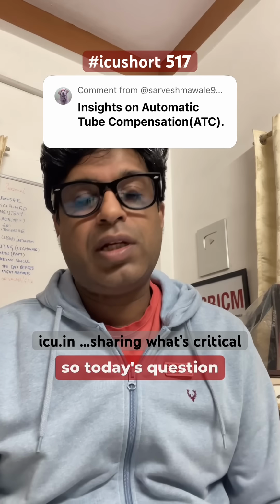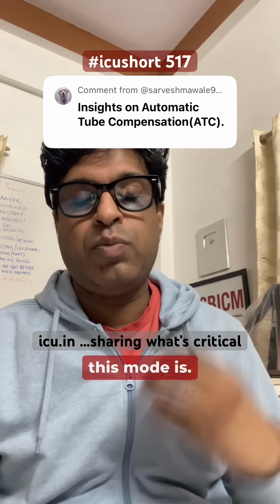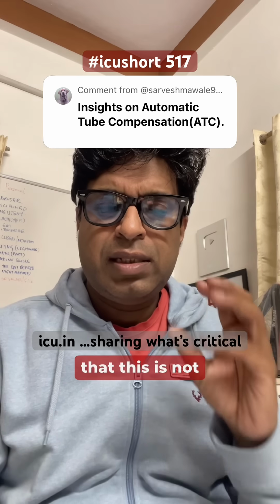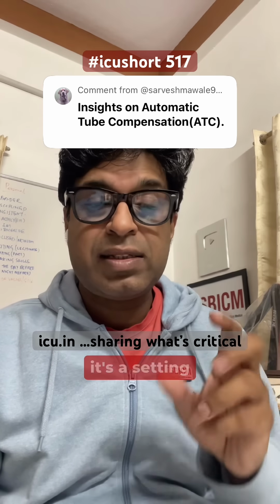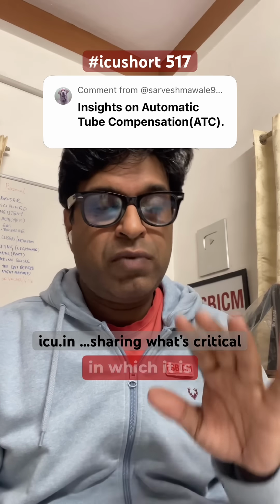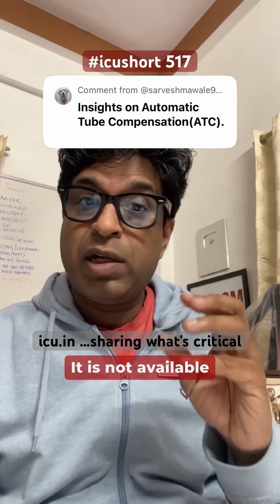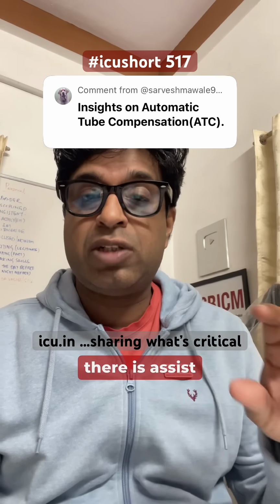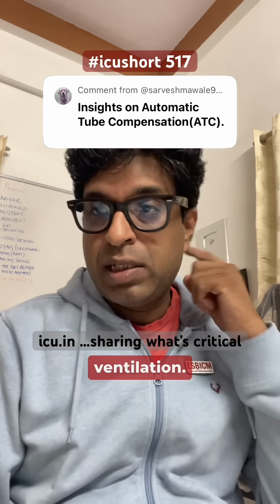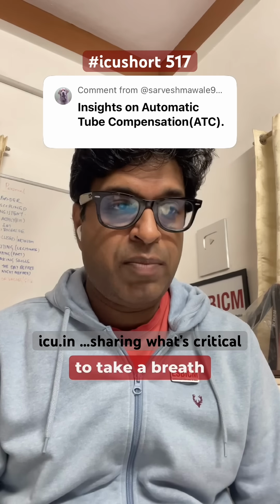Okay, so today's question is what is ATC, automatic tube compensation? So how different is this mode? Understand that this is not a typical mode, it's a setting which is available in certain modes, and the only modes in which it is available are those in which the patient is breathing spontaneously. It is not available in assist control or control mode ventilation. It's only available when the patient takes an effort on the ventilator to take a breath and exhale a breath.